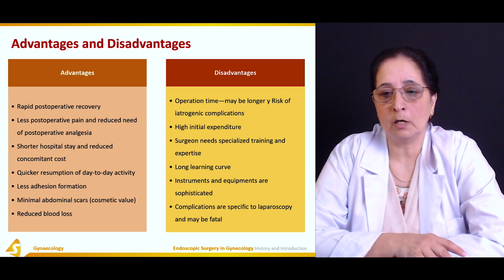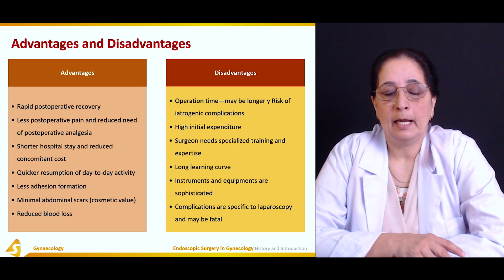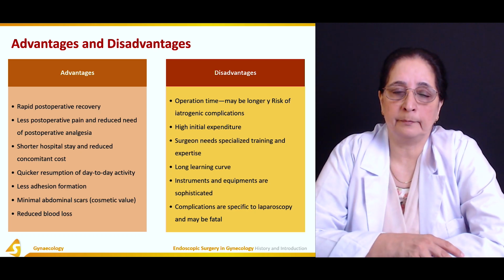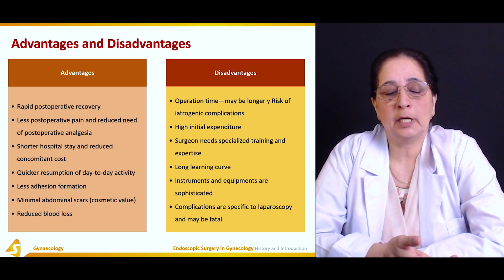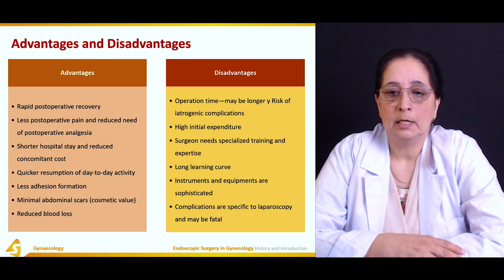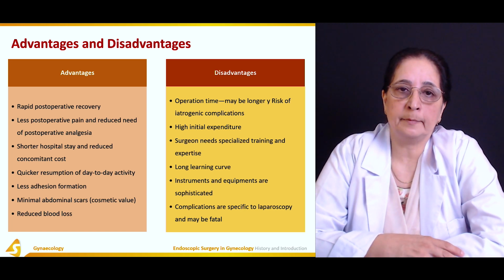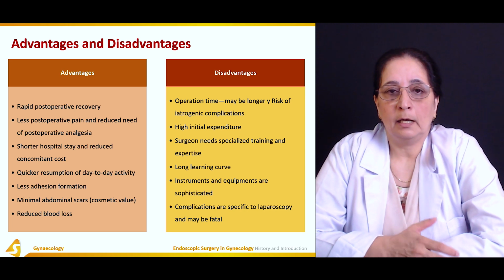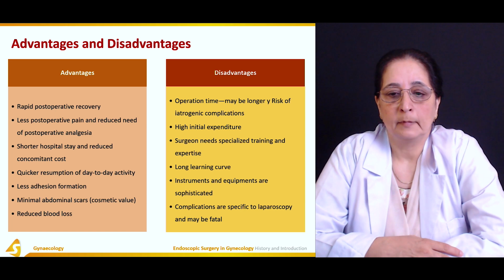Disadvantages are iatrogenic complications, which are doctor-induced complications. During the procedure, sometimes different complications occur. High expense is another disadvantage.